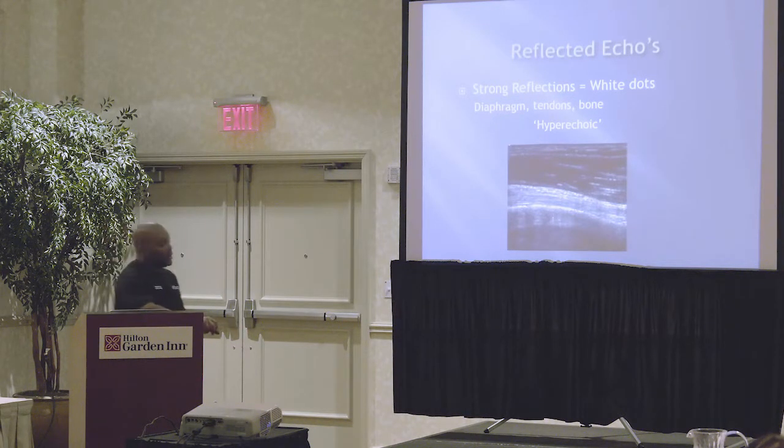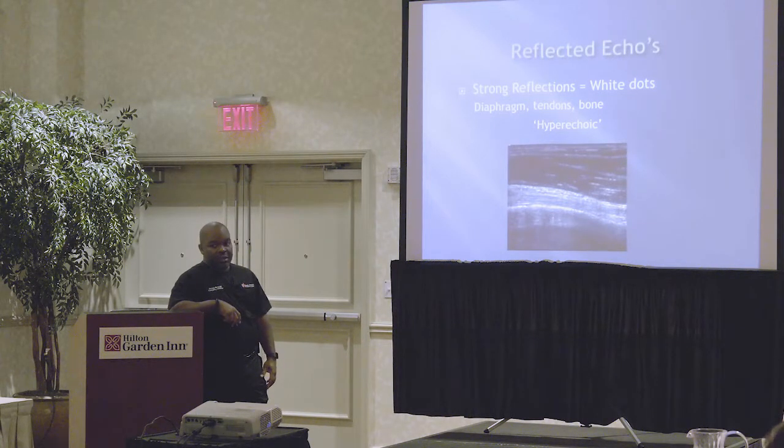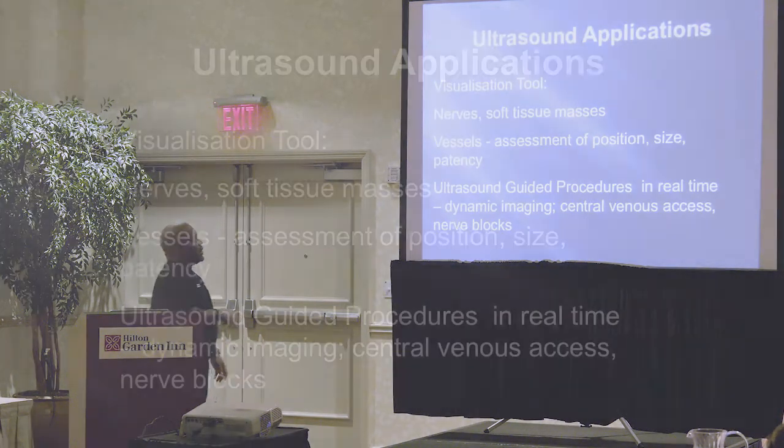And so if one were to rupture the tendon, you would actually see a nice break. And you can see if it's partial or not. So what you'll see is you'll see black line through the tendon. And you'll see it's nice and separated. And it might be jagged, look like a bite or something like that. But if you see it go all the way through, then that will be a complete tear. And if you see it goes halfway through, then there'll be a partial tear. Does that make sense?